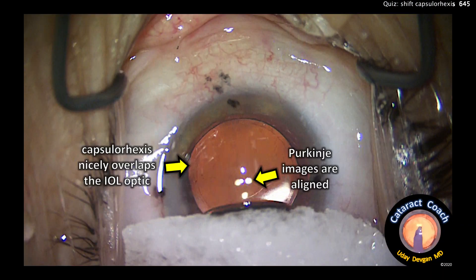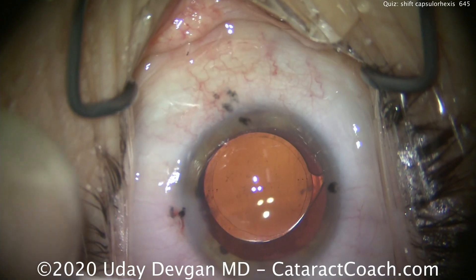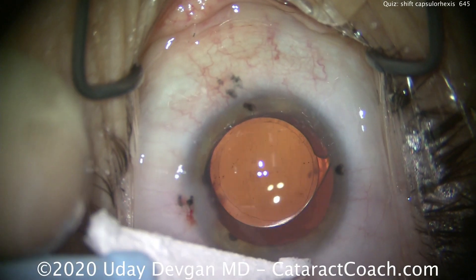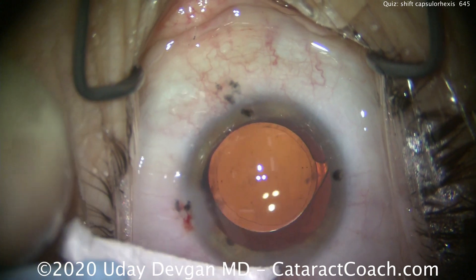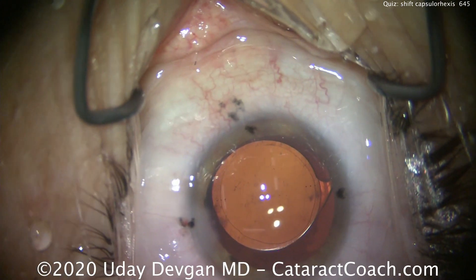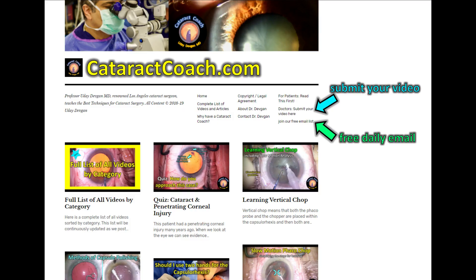That's an important thing to do. Here you can see the overlap of the rhexis on top of the optic, and look at the two Purkinje images beautifully aligned. The patient had a beautiful outcome, and we did a very similar approach for the second eye. So keep this in mind next time. Check out CataractCoach.com, our free teaching website — there's a lot of great material there, much more than my YouTube channel. Click on the full list of all the videos by category and you can see exactly what you want.